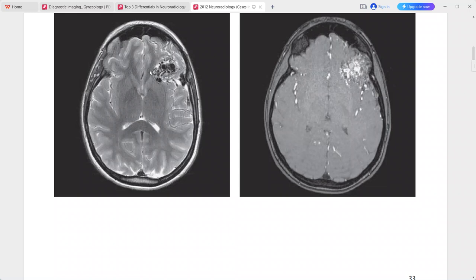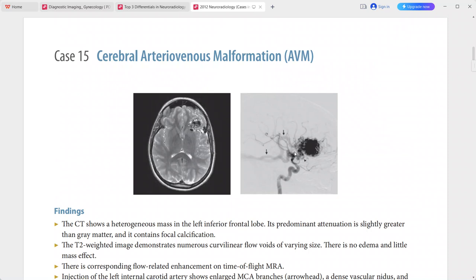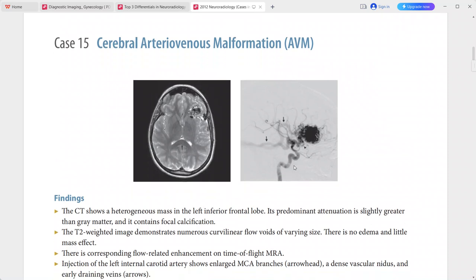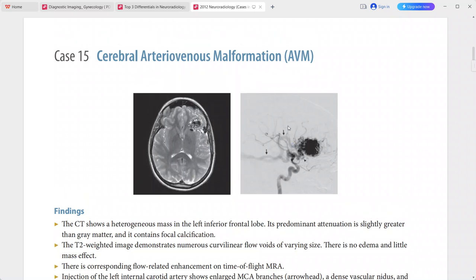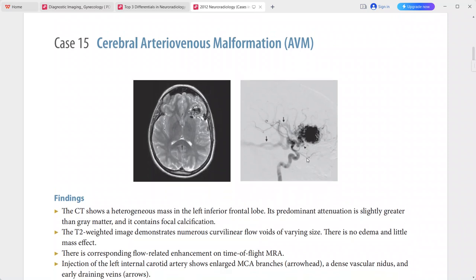There is corresponding flow-related enhancement on time-of-flight MRA. Catheter angiography with injection of the left internal carotid artery shows enlarged MCA branches, a dense vascular nidus, and early draining veins.